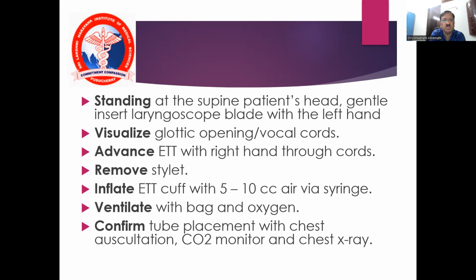So when the patient has been anesthetized or is totally unconscious, at that time endotracheal intubation will be carried out in the following way. Physician stands at the head end of the patient, oxygenates with the bag valve mask with 100% oxygen for 3 to 5 minutes.